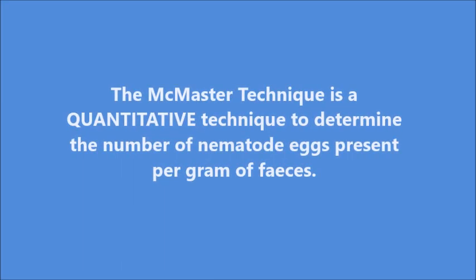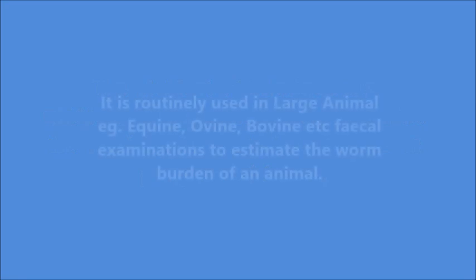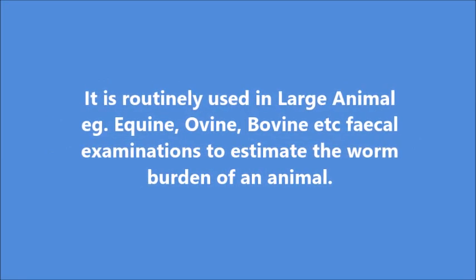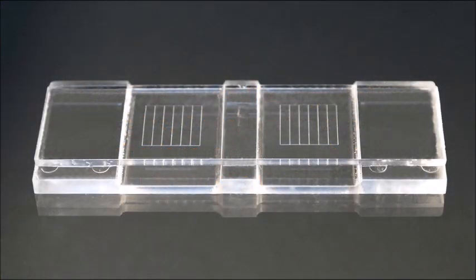The McMaster counting technique is a quantitative technique to determine the number of nematode eggs present per gram of faeces. It is used routinely in large animal faecal examinations in order to estimate the worm burden in an animal. A flotation fluid, for example saturated sodium chloride, is used to separate eggs from faecal material in a McMaster counting chamber.